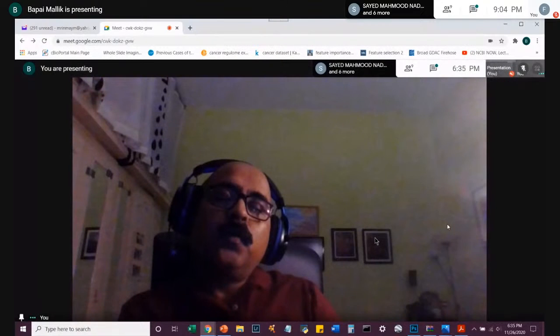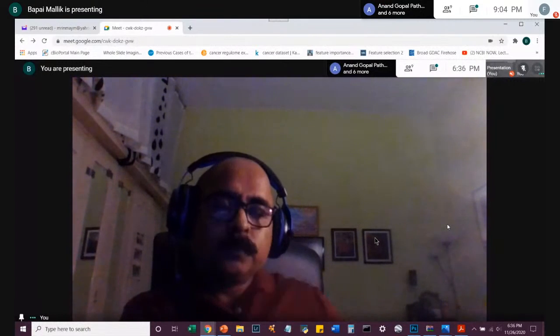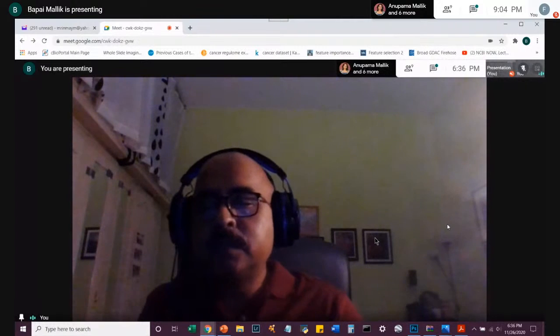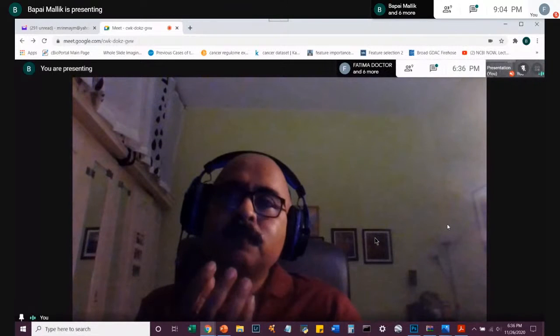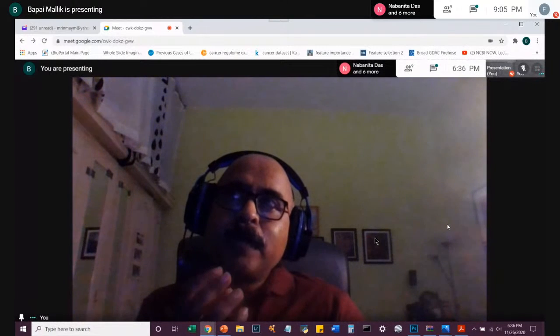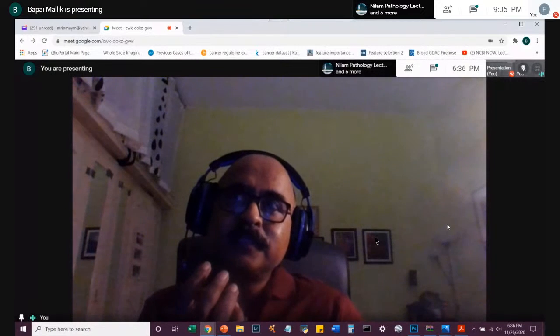Now, Dr. Nabanita Das, she's from Assam. Can we confuse hyalinizing trabecular adenoma with PTC diffuse sclerosing variant? If so, how to differentiate in cytology? Not really. You see, the diffuse sclerosing variant of papillary thyroid carcinoma usually shows so-called balls of cells, a lot of hobnailing pattern, and cells with an abundant amount of cytoplasm and some cytoplasmic secretions.